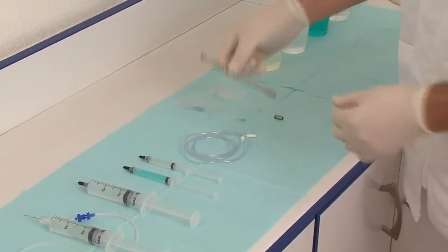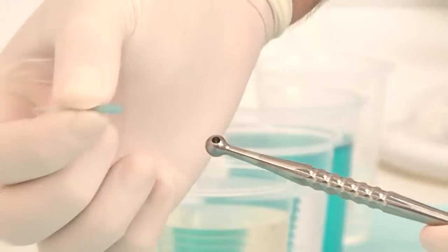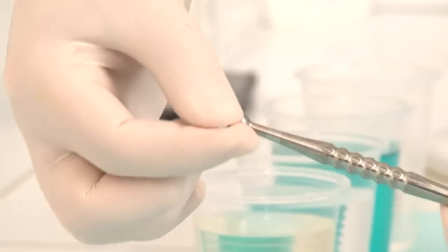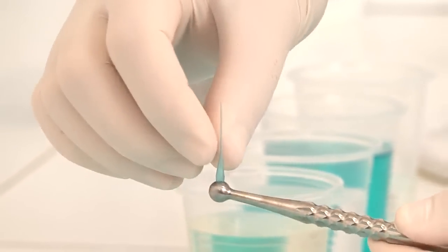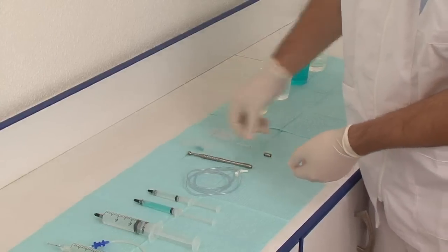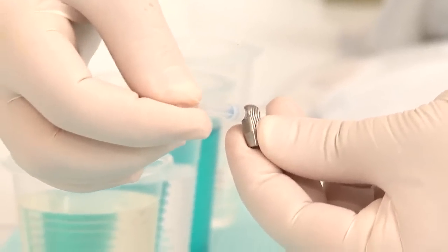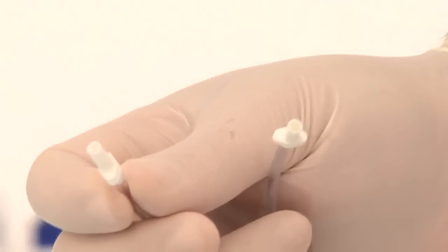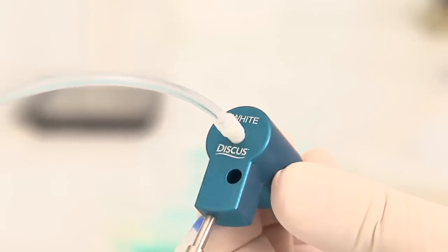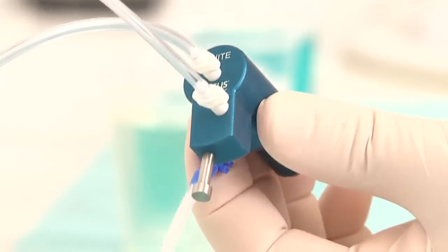This is the holder of the macro cannula that is going to be used in the middle part of the root canal system. We adapt the macro cannula to the holder, tight and firm. And we adapt the micro cannula to the holder. This is the second white tubing. And as you can see here, I adapt the first one that is connected to the suction. And the second one is just a holder for the second end of the plastic tube.